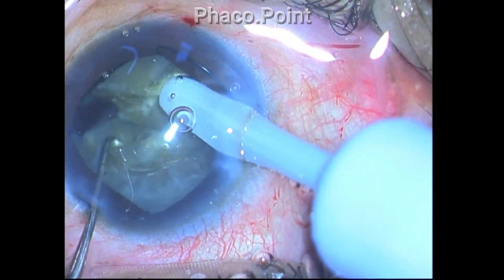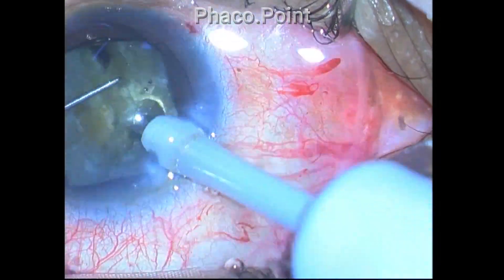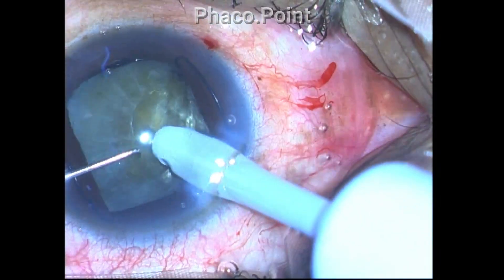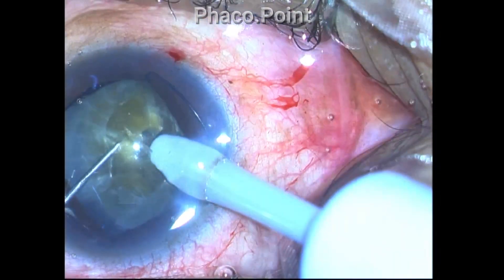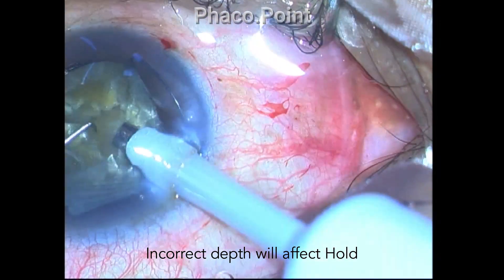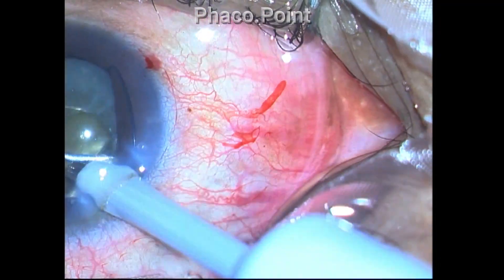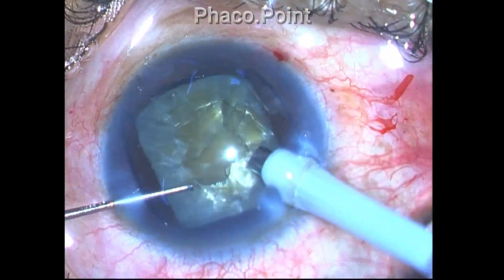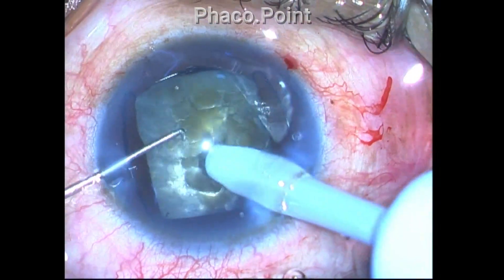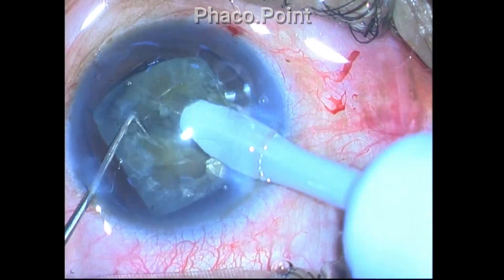When the phaco tip is only exposed to one millimeter, you tend to drive the tip only until the sleeve hits the nucleus. Even if the place of impalement and angle of attack are correct, the depth is insufficient to reach the amorphous core — so when you crack open the lens, the amorphous core remains intact. You can rectify this by going much deeper once the crack has been initiated: bury into the amorphous core. Only then will you achieve a through-and-through crack with the posterior plate splitting open.